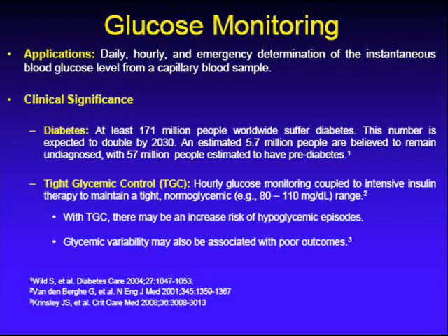Well, there are risks involved with tight glycemic control, and one of the key problems is the risk for hypoglycemic episodes, that is, low blood glucose, less than 40 milligrams per deciliter. The potential for hypoglycemic episodes are increased just because of, one, potential inaccuracy of glucose monitoring devices, as well as various pathological states that are found in these patients. Some patients may have a higher insulin resistance versus others, and vice versa.